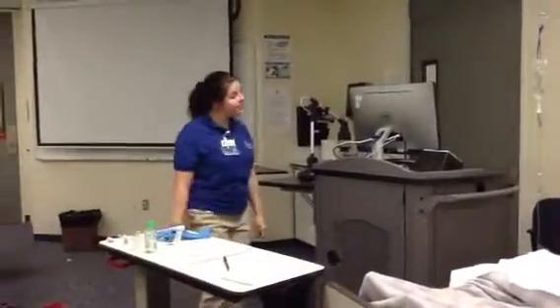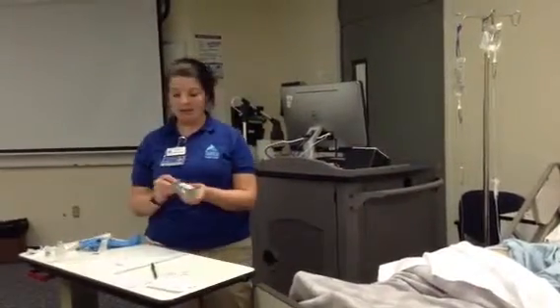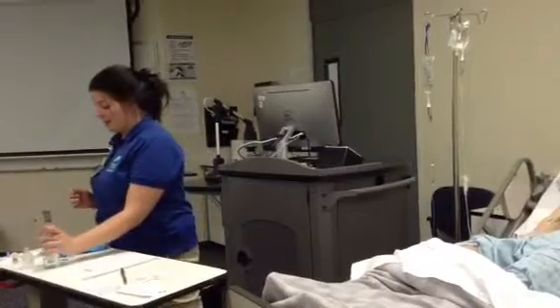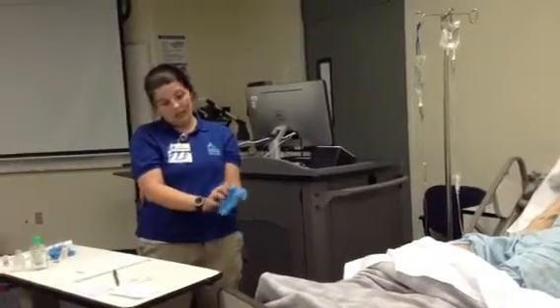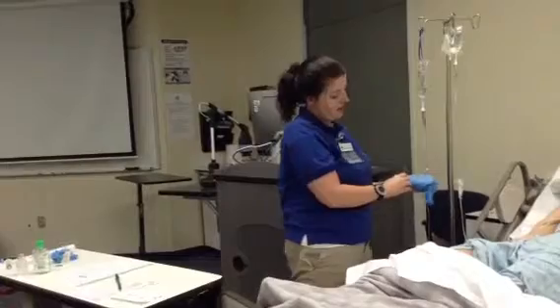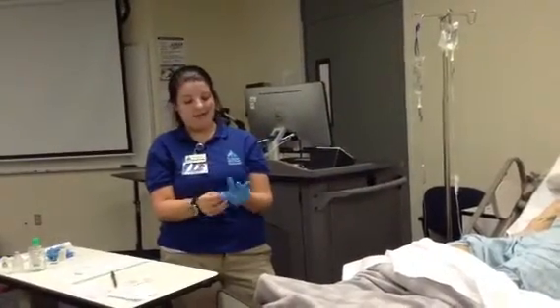Alright, Mr. Jackson, how are you doing? It's been 30 minutes and it looks like your medication has gone all the way through. I'm going to go ahead and do some more hand hygiene. And you want to go ahead and say your name and date of birth for me just for safety reasons? Okay, good. Alrighty. Let me go ahead and put my gloves on since I just did my hand hygiene. And let me look at that site. Everything looks good at the site. Okay, good. Alright, you're feeling great, right? Good.